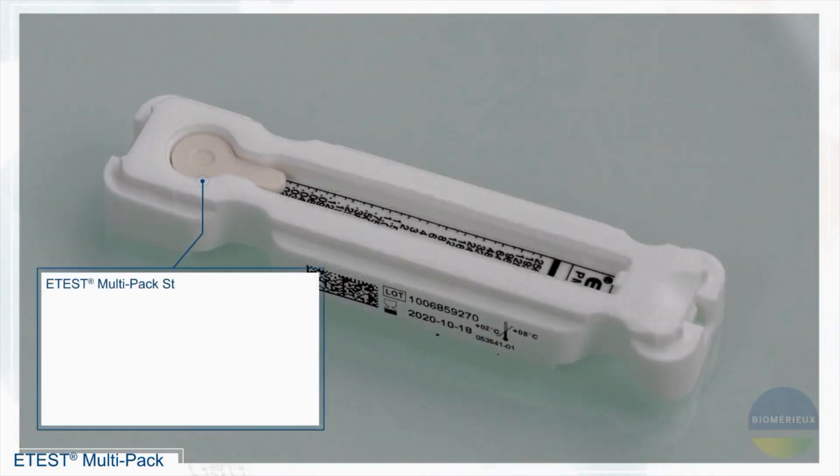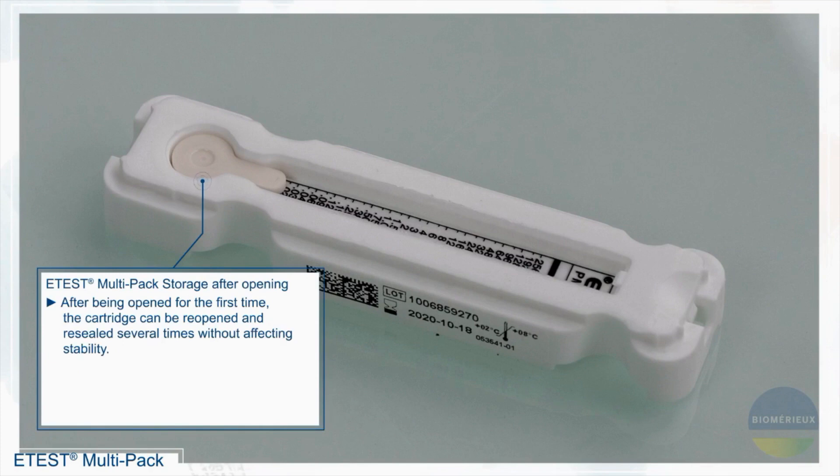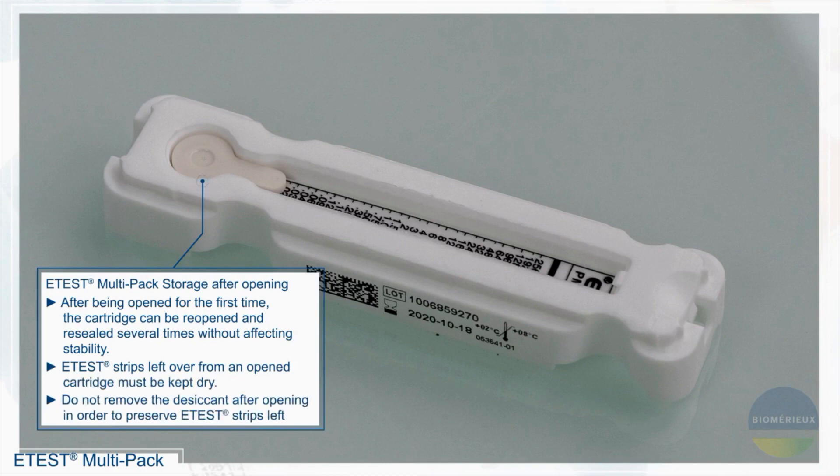eTest multipack storage after opening. After being opened for the first time, the cartridge can be reopened and resealed several times without affecting stability. eTest strips left over from an opened cartridge must be kept dry. Do not remove the desiccant after opening in order to preserve eTest strips left over.